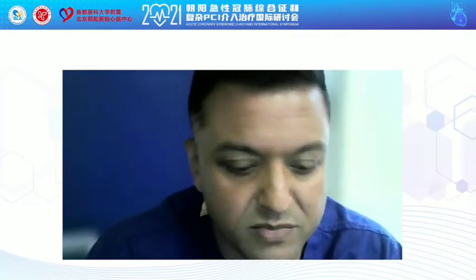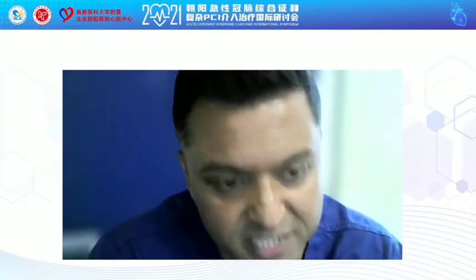I think CT in general for CTO is very useful to get an understanding of what the distal vessel is like. And now the technology has got such that you can integrate your CT imaging into the cath lab as well. So you've got that information live and direct, rather than something you can only look at in your office before you start a case. You make an excellent point about the use of CT to understand the nature of specific lesions.